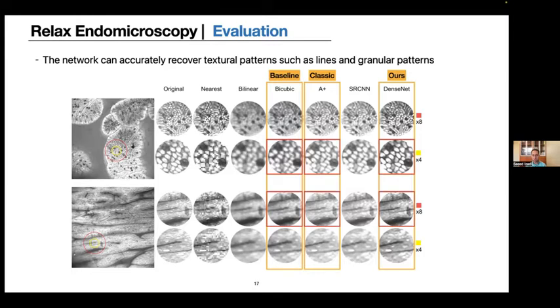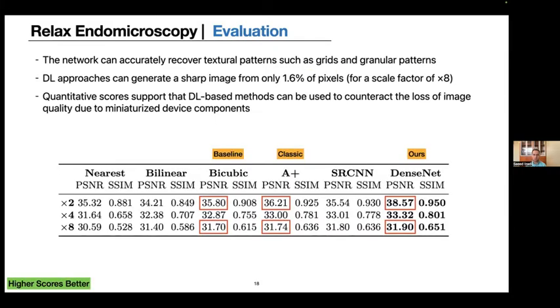Comparison of the red boxes that I highlighted across these three methods reveals the potential of advanced deep neural network architectures in reconstructing high frequency cues and removing visual artifacts. And numerical results come in this slide, which remark the quantitative improvements of advanced deep learning based networks over baseline and classic super resolution algorithms, highlighted with the red boxes.